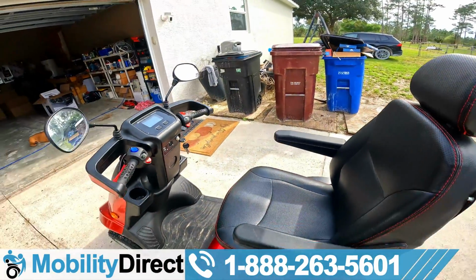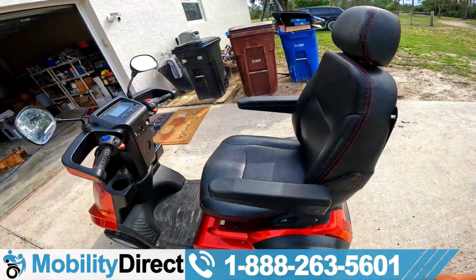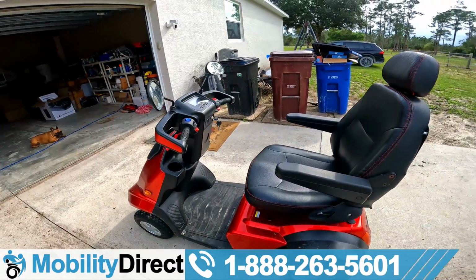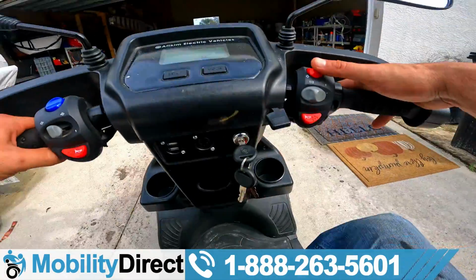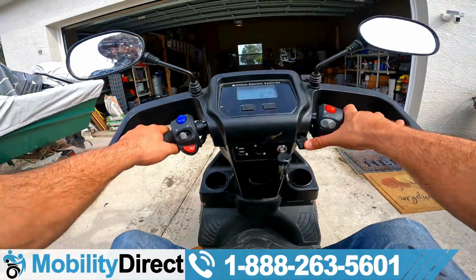There we go. The seat's in. You know it's in because it's not going to rotate. So let's go ahead and test it out now. All right, so everything's back together here. Let's see what happens. I'm confident that now everything's going to work just fine.